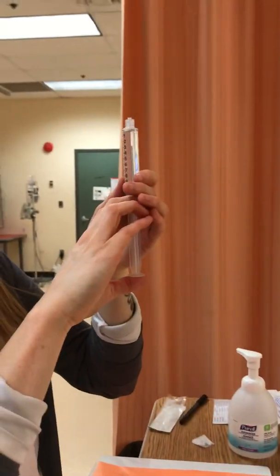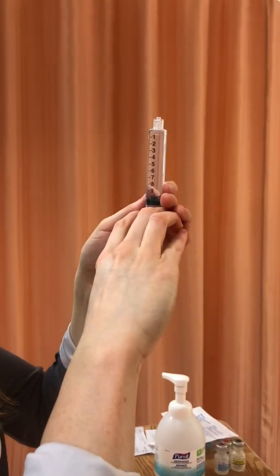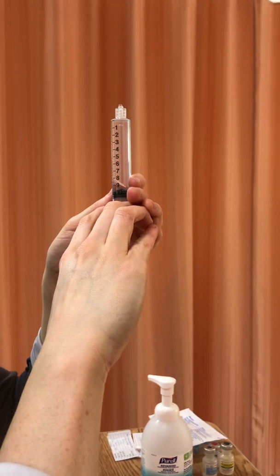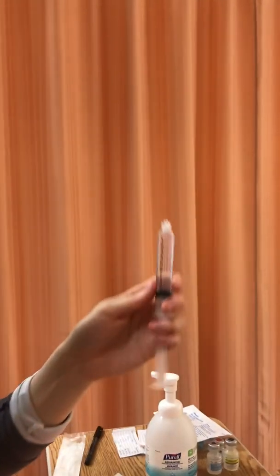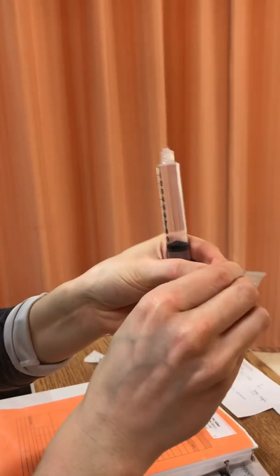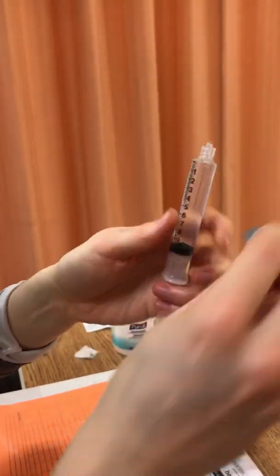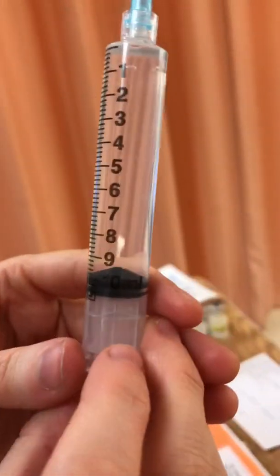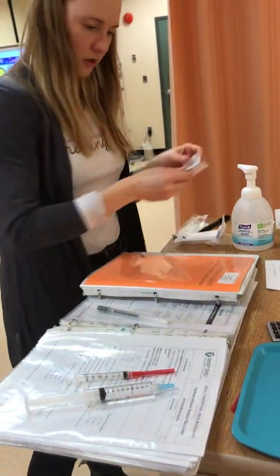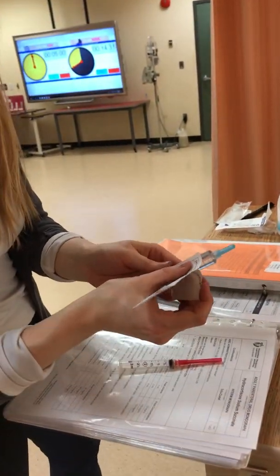So now I will push this up to 10. Perfect. And grab a blue cap to close that. So I've got my final volume of 10 milliliters right there, and that is my reconstituted drug. Okay, at this point I am ready to label my drug with the medication label that I've already prepared.